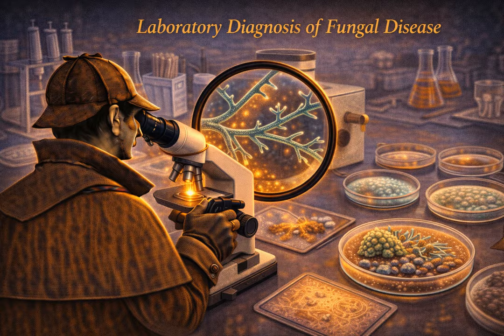It is critical. Cycloheximide is actually an antifungal agent itself. It targets eukaryotic protein synthesis. Wait, we intentionally put an antifungal in the fungal culture media? That seems completely counterintuitive. We do. Because just like there are weeds in a vegetable garden, there are weeds in the fungal world. These are the saprophytic molds, the rapid environmental growers that live on bread or in the dirt outside. Penicillium, environmental Rhizopus, things like that.